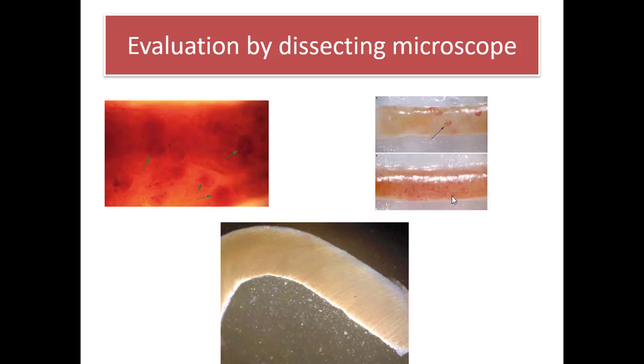After taking the core, one of the very important things I would like to do in the renal biopsy room is to evaluate the core of tissue you take from the kidney. Because I can take tissue from the perinephric fat, I can see glomeruli like this one. This is a core of white tissue. There are no glomeruli. Where are the glomeruli? Those are the glomeruli. Those red dots are the glomeruli.